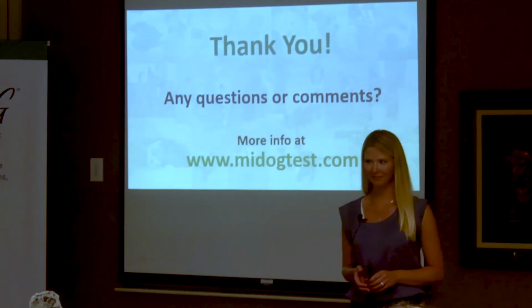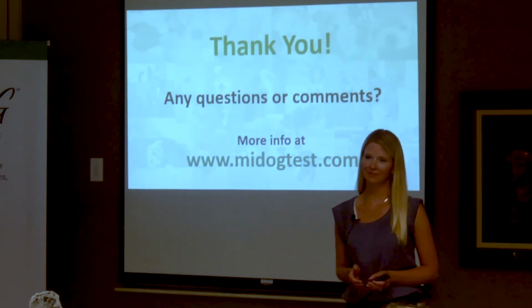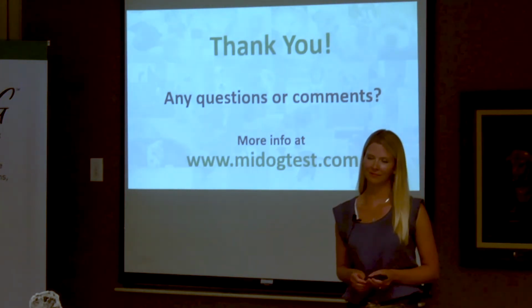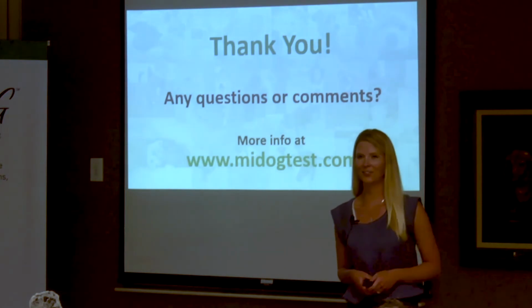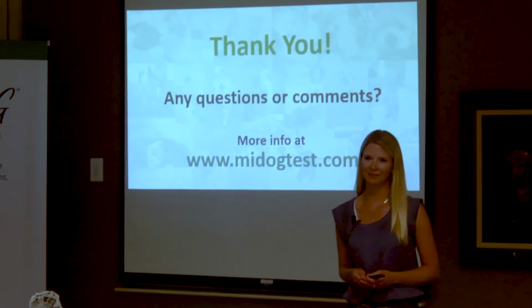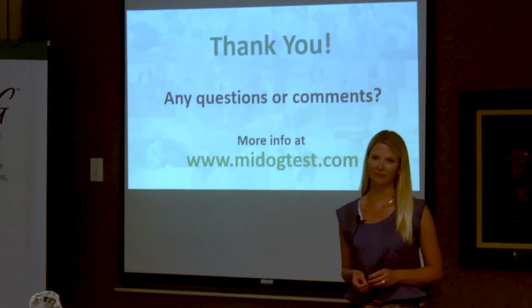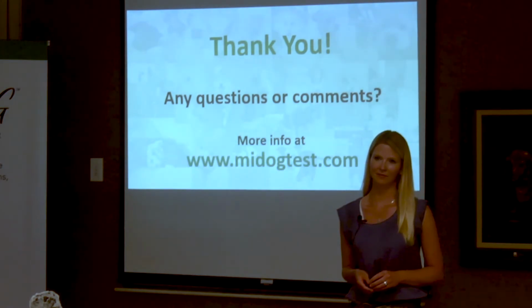But in any case, are you timing it? Is that how you get the abundance, by how much replication or amplification you get at a certain time point? Well, that's a Xu Chang question right there. It is by PCR. Yeah, absolute quantification. Now you're not doing it by hand. There's a machine doing the cycling.